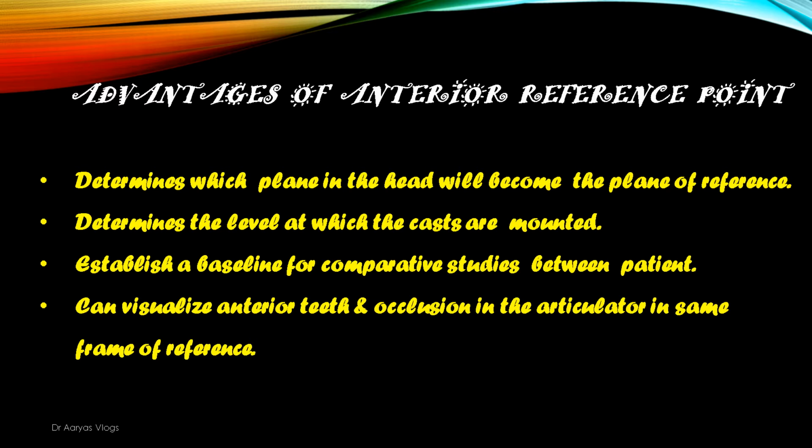And then determine the level at which the casts are mounted. Establish a baseline for comparative studies between the patient. It can visualize anterior teeth and occlusion in the articulator in the same frame of reference. So these are the various advantages of the anterior reference point.